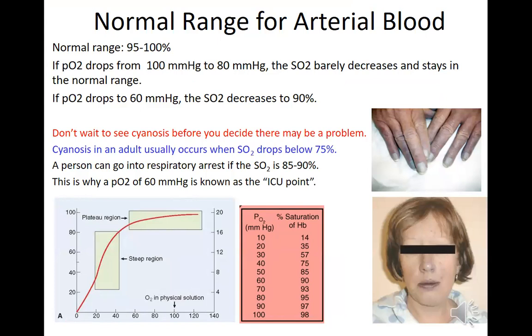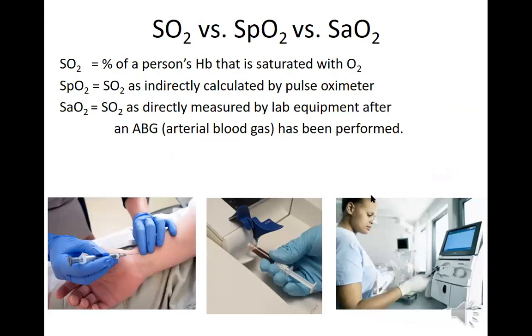And I mentioned before, of course, when you're doing pulse ox, finger pulse ox, SpO2, you never do it on the same side as you're taking blood pressure because you're occluding the blood flow to the peripheral tissue, right? And also the nail polish could make a change. If it's a darker acrylic nail polish, it could change the absorption of the infrared light or red light. Also the lights from the ceiling could change the pulse oximeter absorption. So you put a washcloth on top. Sometimes that'll help to block the light to make sure all of these are normal.